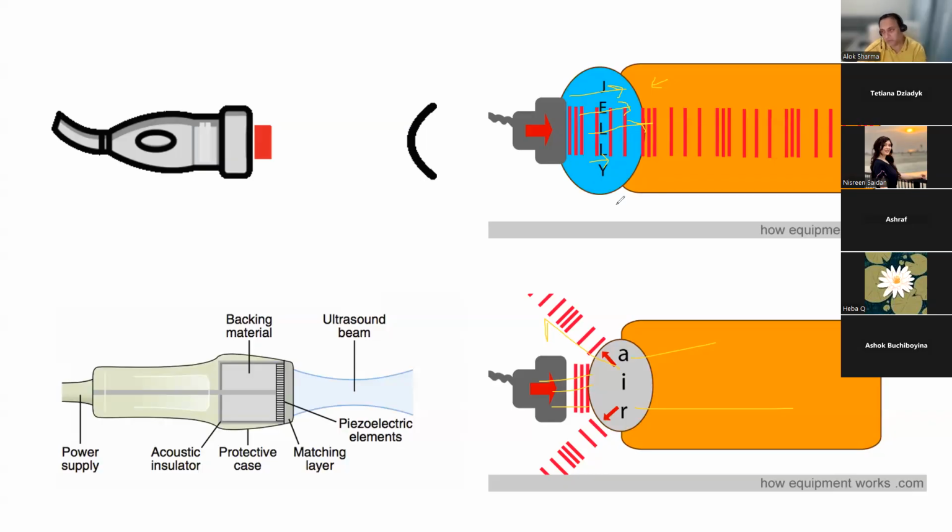And that is the principle and why we use jelly whilst we're interacting with a probe and tissue. Any questions on that? Any questions? So you can write your questions in the message box as well. I'm quite happy to answer that.